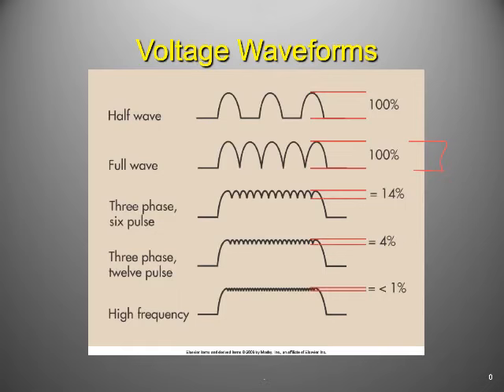Back in the day, that used to happen, though. Our 3-phase 6-pulse machine would lose a diode, would blow out, needs a diode replaced. Okay, double down on all your techniques until the engineer can come out. Yeah.